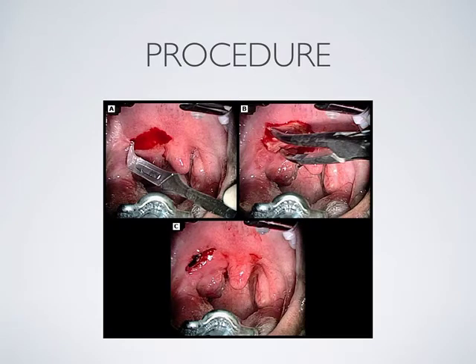Aspiration is then followed up with mucosal incision and opening of the peritonsillar space to allow continued drainage. An 11-blade scalpel is used to make a 1 to 2 centimeter incision just through the soft palate mucosa at the site of aspiration. A curved hemostat is then used to spread into the peritonsillar space, breaking up any loculations and expressing more purulent material. The procedure is then terminated.